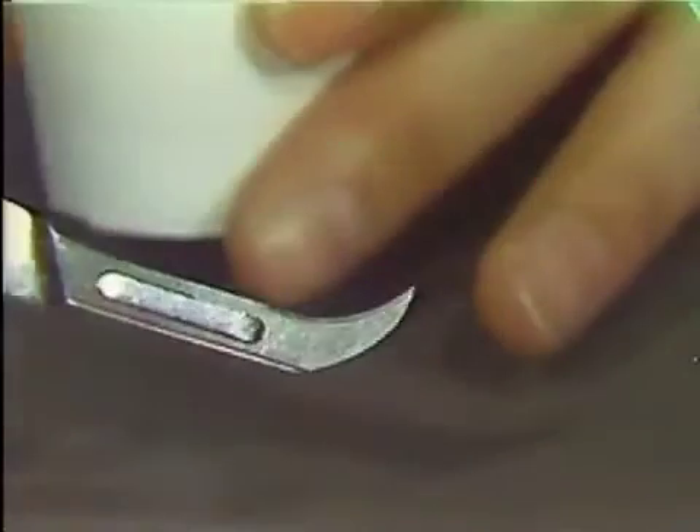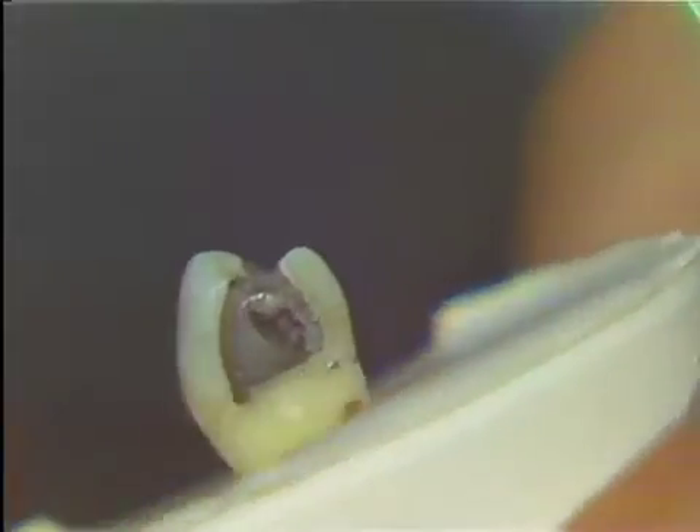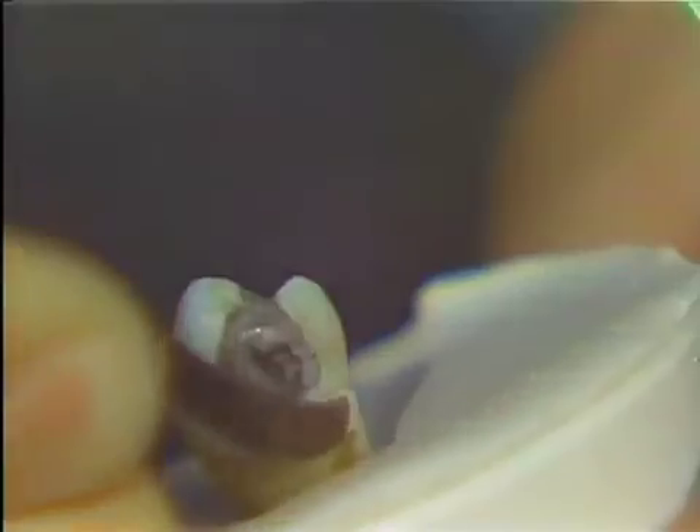The best way to show you the effect of this: if you look very closely, you can see a little spur of calculus here. I'll position the blade and show you the way it will be used in removing an overhang. You can see that it is used with much like a scaling stroke, but only the tip of this instrument is used. Use a very short, controlled stroke and get right under the overhang to remove it.